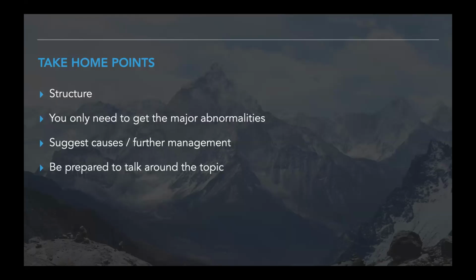So remember that when you finish talking through a radiograph, your job is not over. In an exam, you're looking to score points. You're looking to get as many marks as you can. It's like an interview where no matter what the question is, you just kind of crowbar in all the stuff that you've done to show how brilliant you are. And so if you see a classic, uncomplicated, i.e. no perforation, small bowel obstruction, not only do you get the diagnosis by presenting beautifully, you will then go on to say the most common causes are X, other causes include Y and Z. In terms of management, I would do X, Y, and Z, just to show that you're thinking holistically like a doctor and not like a machine that reports radiographs.